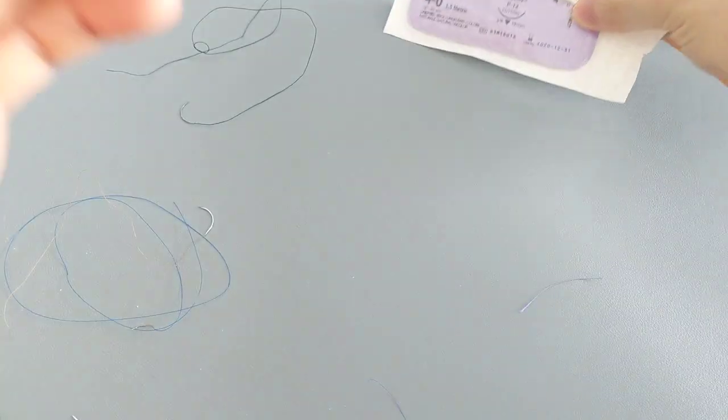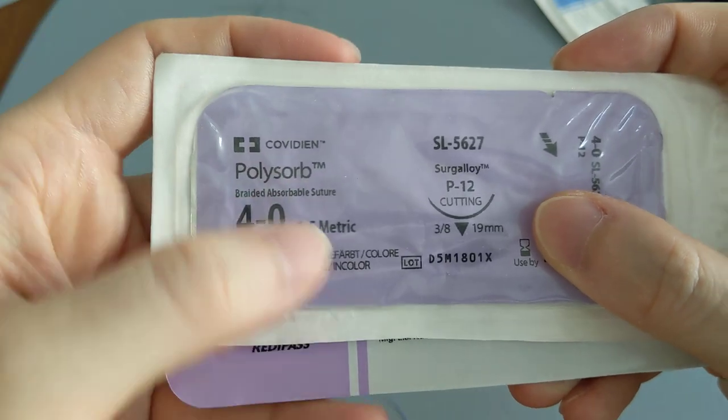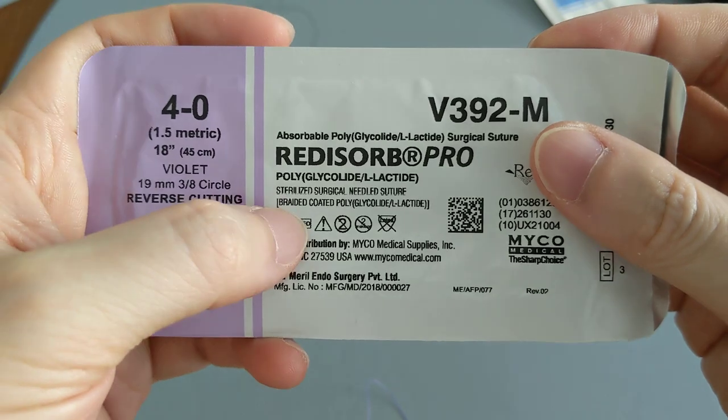And that makes them braided. A lot of sutures are braided. So here we have one that says braided — braided absorbable. I have a different one here, another violet one. It says braided, another braided suture.